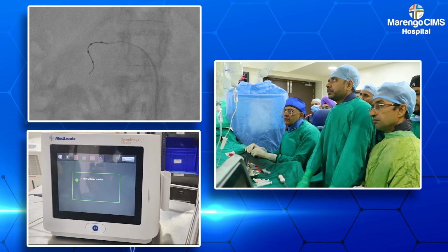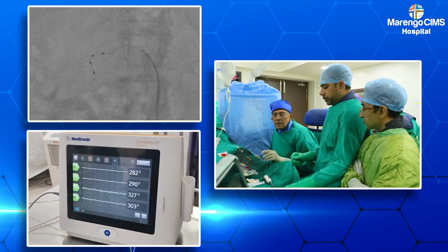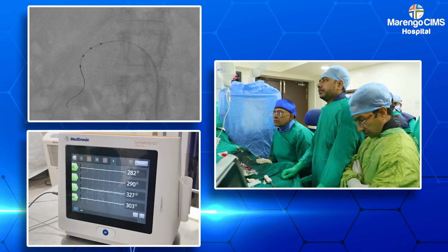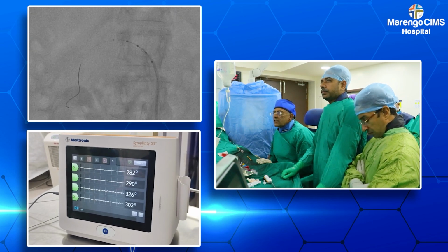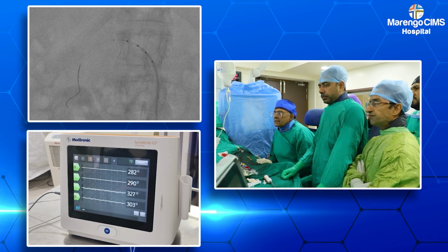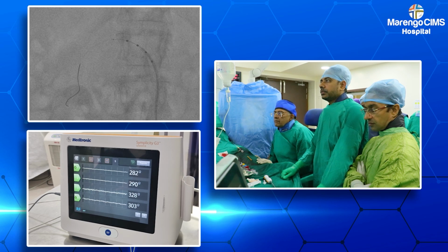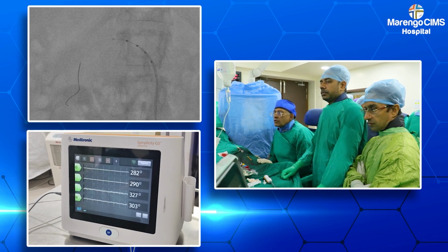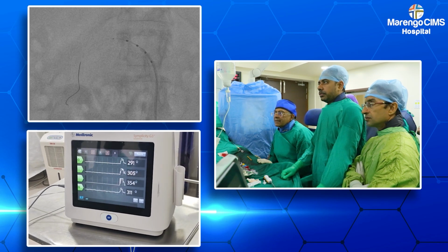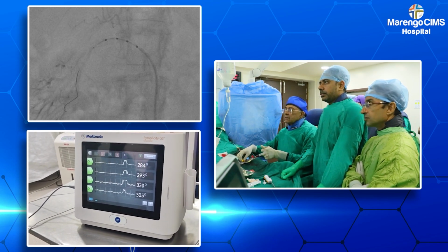So now we have pulled back the spiral catheter. We have pulled back the wire from the inferior branch. We advanced the wire into the main artery, into the distal branch, and repositioned the spiral catheter as you see in the runs, and we are now going to ablate where originally the third electrode was switched off due to poor contact. Now we've been able to get the second electrode to touch, as you see in this run.